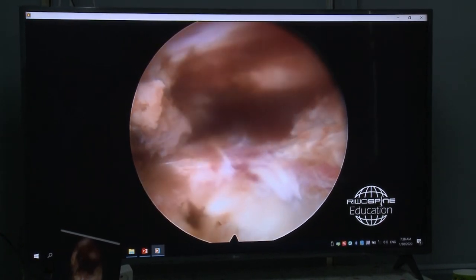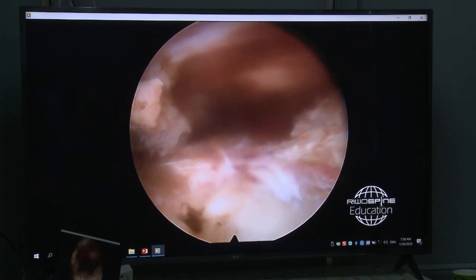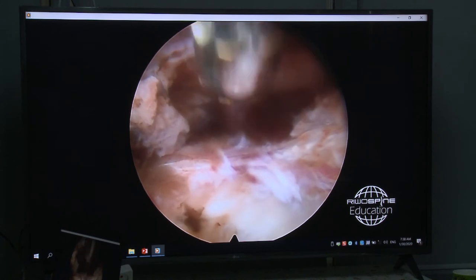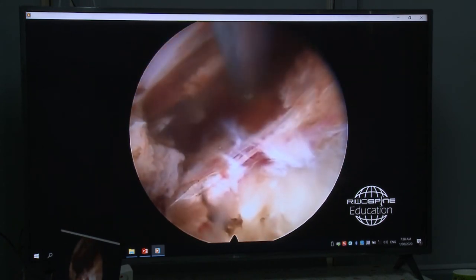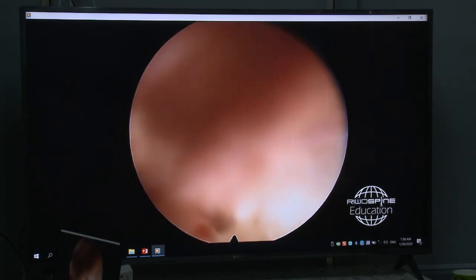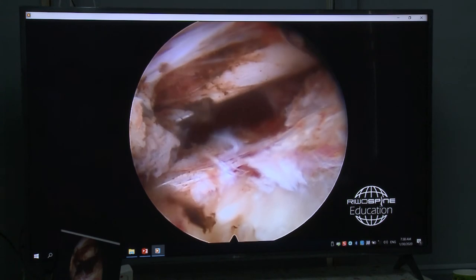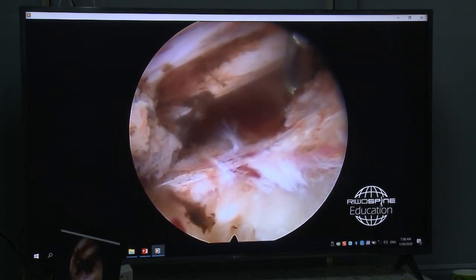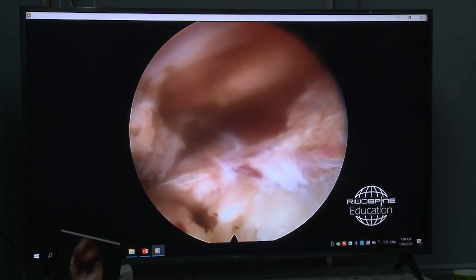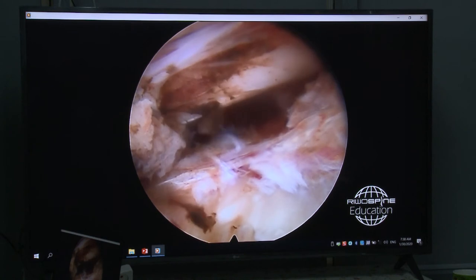Now you see the floating, the movement of the epidural area, and this is the sign of decompression. Just check a little bit for the smaller pieces, and also check inside the disc a little bit for free fragments. See, the structures came down.